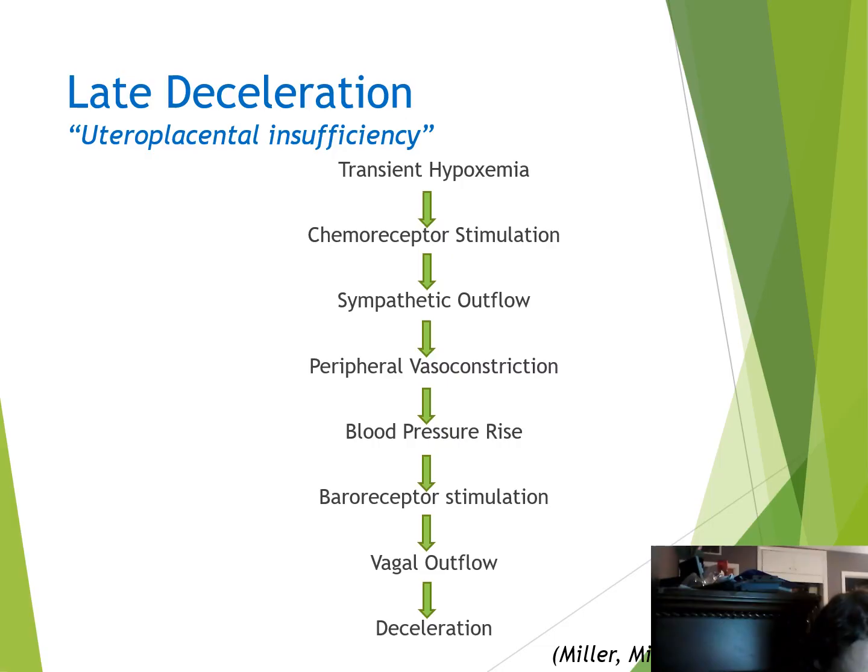So what are some causes of late decelerations? Well, honestly, you can look right in the chart in your book to see it. But the big causes that we talk about a lot are maternal supine hypotension, of course, and then that hypotension that's caused by the epidural. You know, we talked about the decreased systemic vascular resistance, that vasodilation that happens in your blood vessels. Other things like placenta previa, placenta abruption is a big one. It's kind of one of the ones that I think the doctors always immediately think about when they see late decelerations. And then everything else, hypertension disorders, anything that's causing a concern with that placenta not working properly can definitely cause late decelerations.